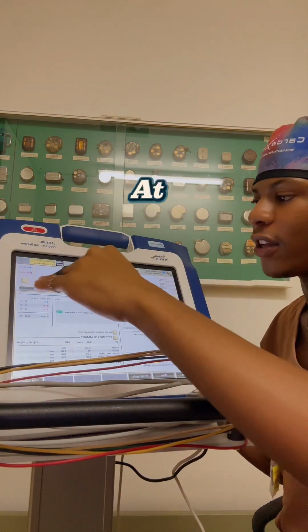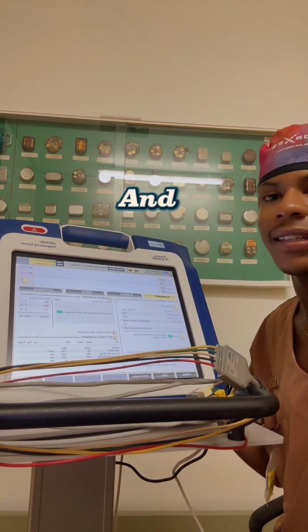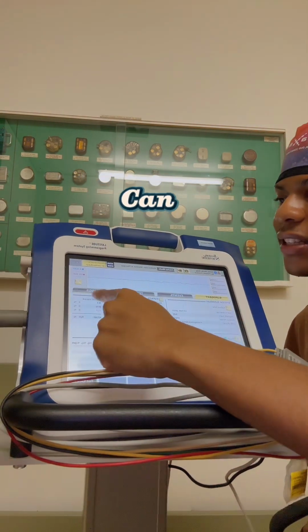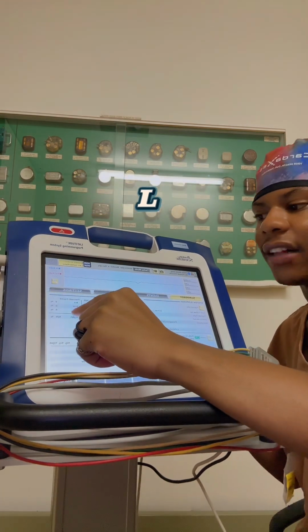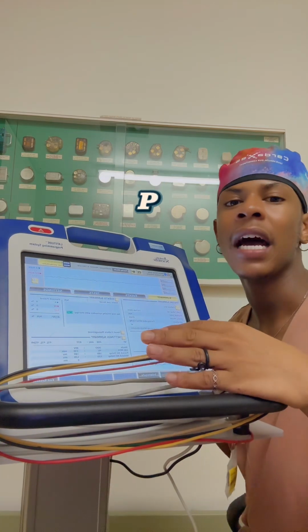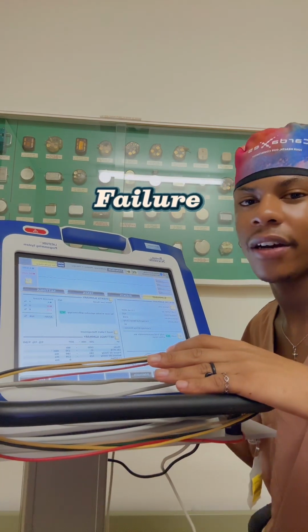What you do first is look at the rhythm the patient is in. After you have seen and identified the rhythm, you look at the pacing percentages. I'm not sure if you can see there, but it tells you how much the atria are being paced, how much the ventricles are being paced, and how much the LV is being paced in cases of CRT-P devices that have the leads usually used for heart failure patients.